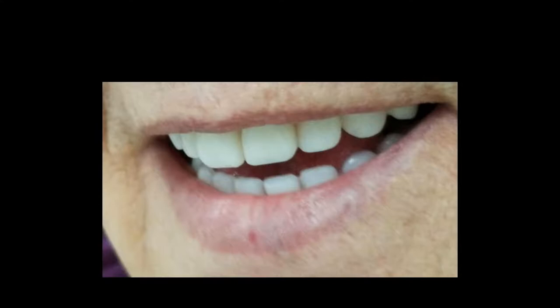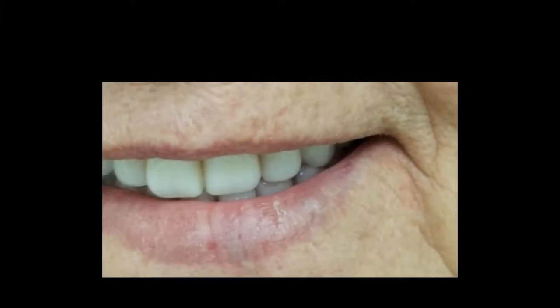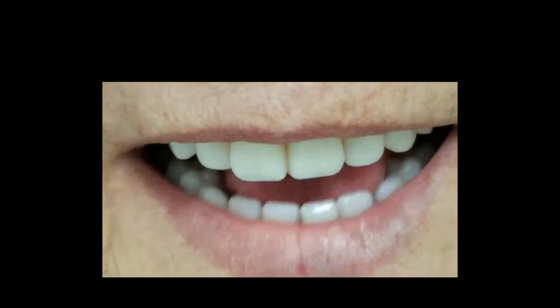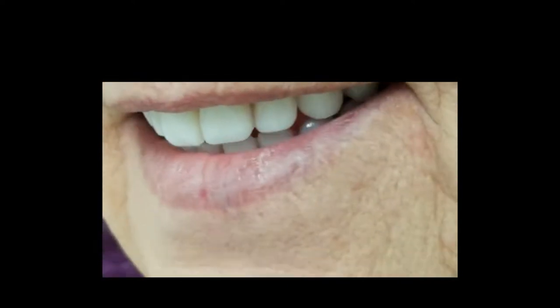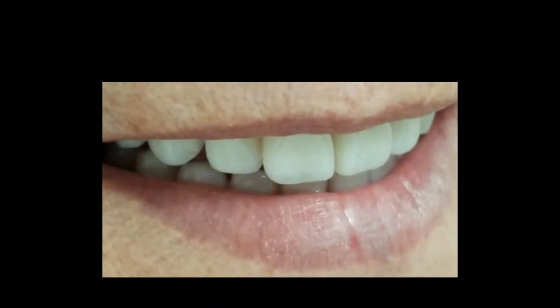Before we would have 66 to check anterior tooth placement against the lower. I'm checking for clearance. I'm checking against smile line. These things that the 66 does. I'm also checking the S sounds for the tongue. But now you can retrain your eye to look at the posturing of the mandible. Do you see the lower comes to the left? See it move? It did not come straight out. It postured forward and to the left.